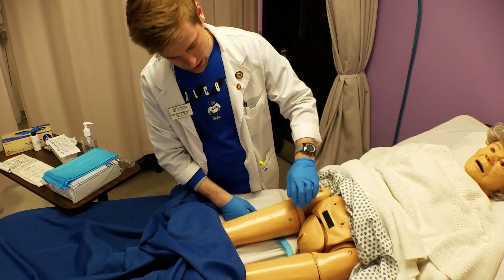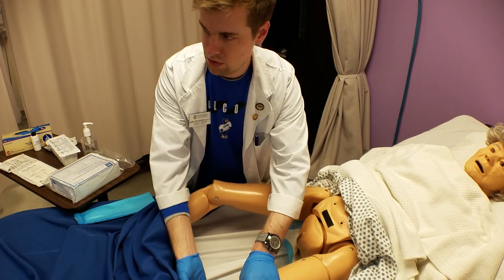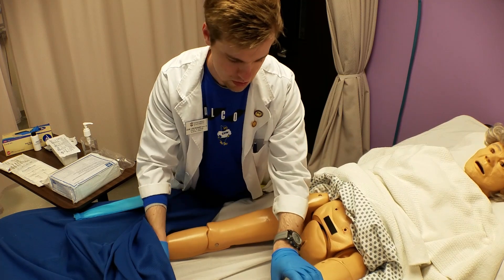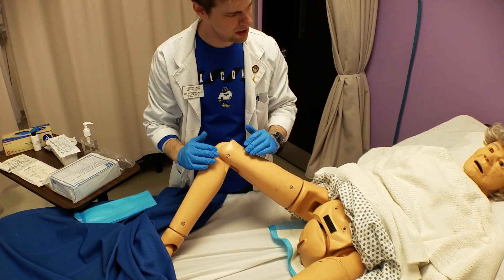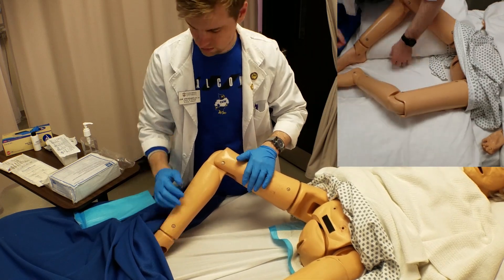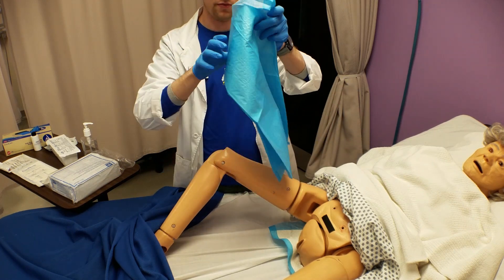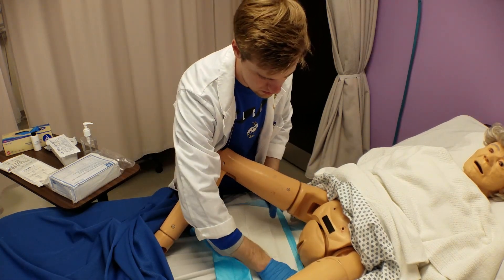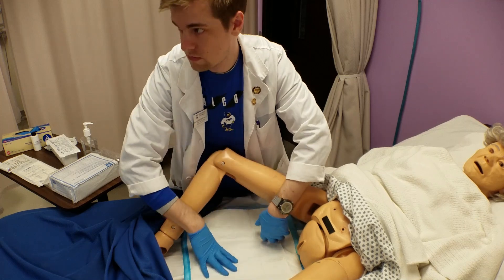We will start with the female indwelling catheterization. Begin by putting the patient in a dorsal recumbent position for perineal assessment and catheter insertion. Starting in a supine position, bend their knees and abduct them to the sides while the patient relaxes. Avoid excessive abduction on patients with bad hips, and consider supporting the legs with pillows as needed. Place a waterproof pad under the patient and continue to cover the patient as much as possible. Adjust your light source to illuminate the perineal area if needed.